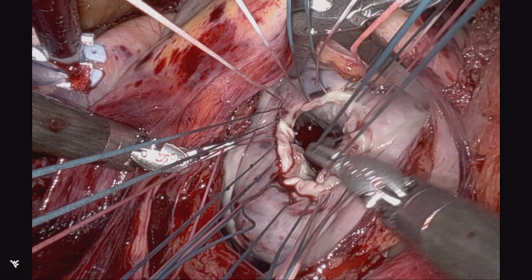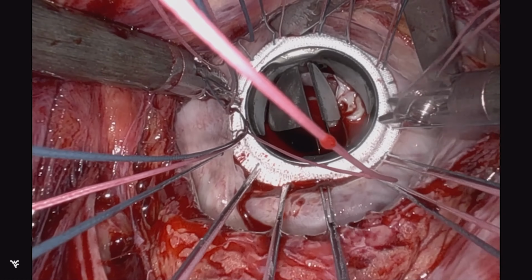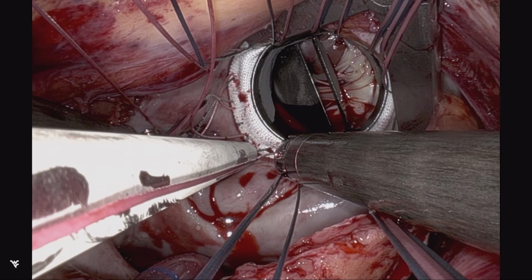As you can see, we have a total cord sparing setup, and then place the sutures extracorporeally, take the valve off of the holder, and deliver that in together. The important thing is that this is a two-person approach where we work collaboratively to align the valve so that suture placement can be coaxial. As you can see, I tilt the valve so that it aligns well, and holding the suture fasteners so that the next bite becomes easier.